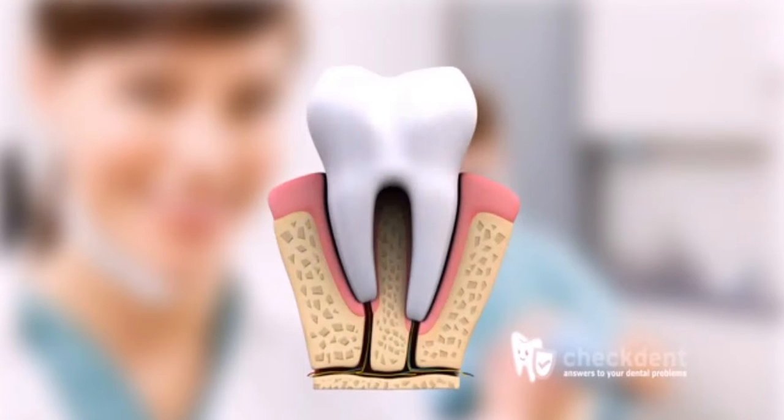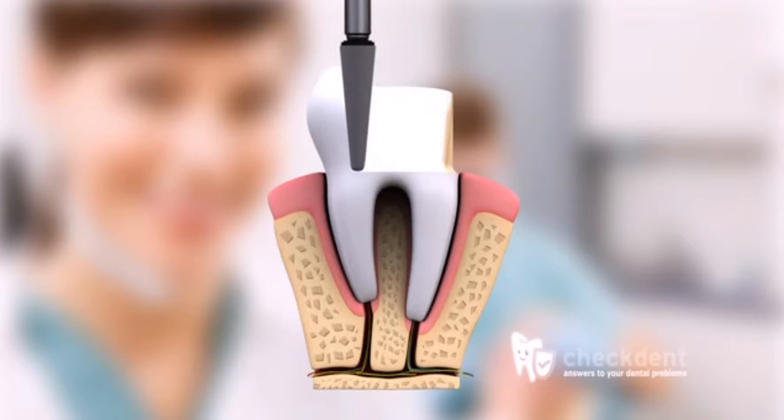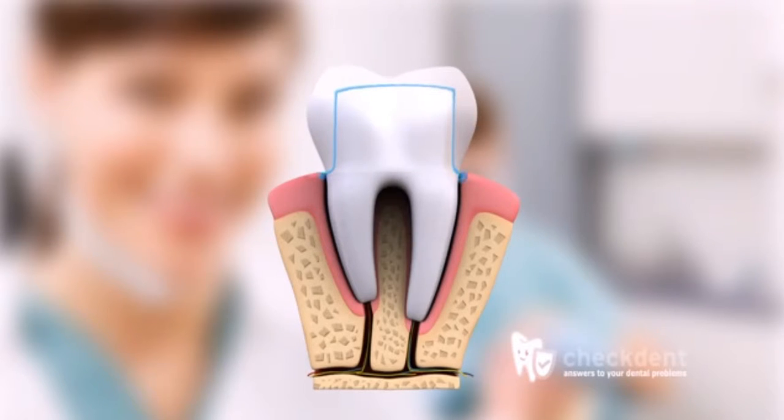In the round margin abrasion technique, the advantages of the other techniques are combined, and the disadvantages are eliminated. However, this technique is the most complex. The adhesive can flow easily during cementation. This allows for a thin joint. The technician has enough room for the ceramic, and the edges are tightly closed, preventing food lodgement.